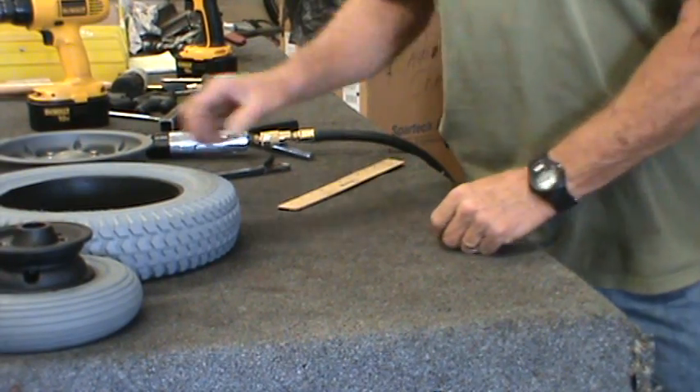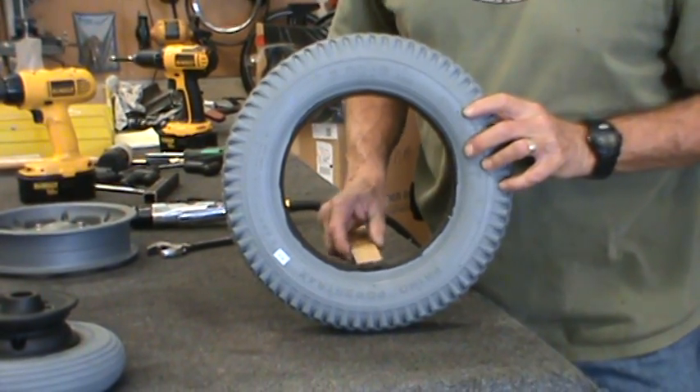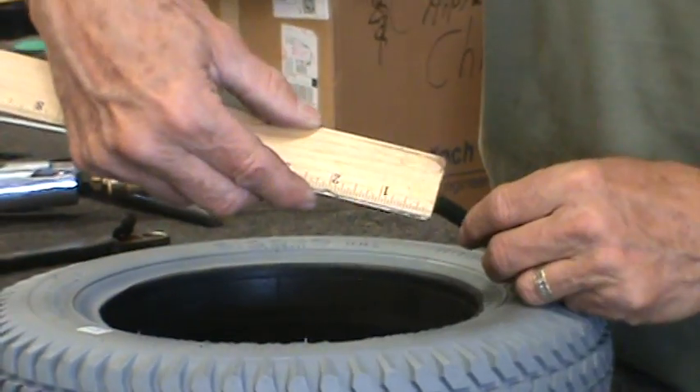Here's another tire. This is a 300 by 8 and the bead width on this one is a bit wider, as you can see. It measures about two and a quarter.